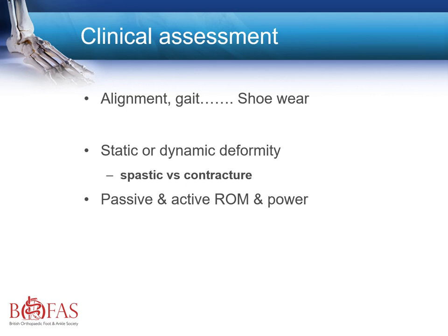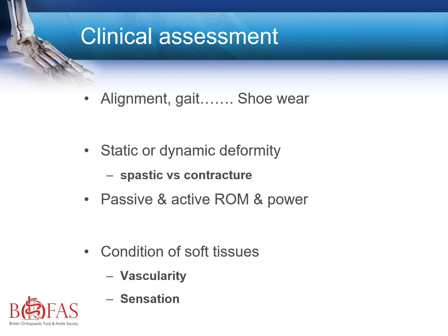An assessment of whether the deformity is static or dynamic, whether the muscles are spastic or is there a contracture, and to fully assess both the passive and active range of any joints and associated power of tendons moving across the joints. All these are key in your assessment.